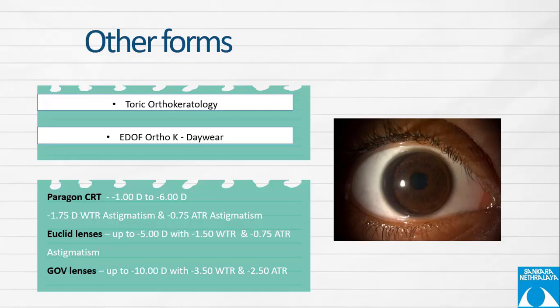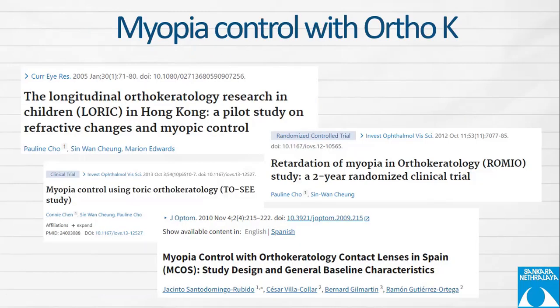So other forms of Ortho-K, we have a toric orthokeratology and EDOF Ortho-K daywear prescribed by the SEED technology. The tabular column below shows the available lenses in India and the range of powers they have availability for. Coming to myopia control with Ortho-K, we have already had a brief introduction to this by Dr. Jitendra Jitani sir, that combination therapies are working well.